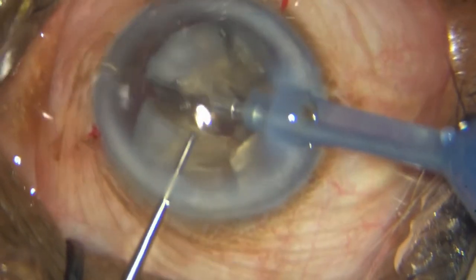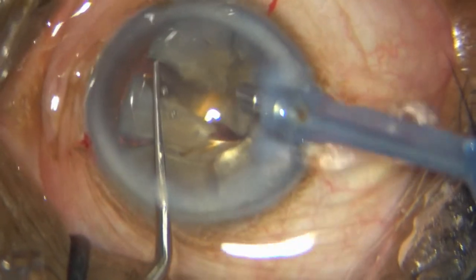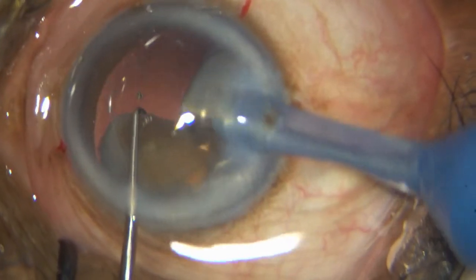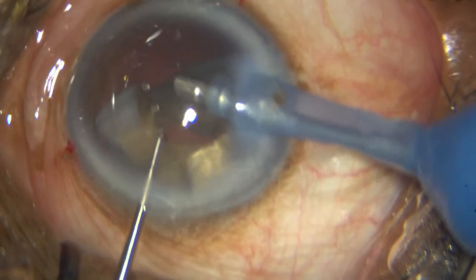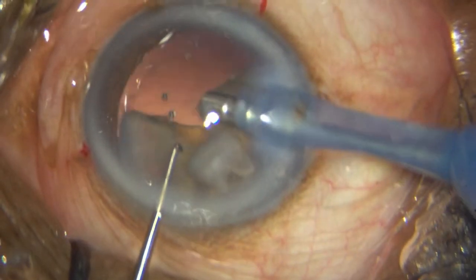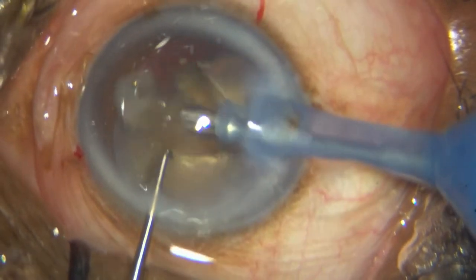You can see that central area — you can see the red reflex through that central area. So I know it's time for me to eat up the segments. And that's one hemi-nucleus done.